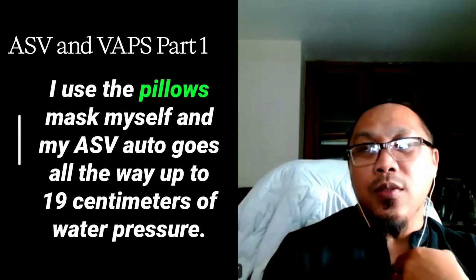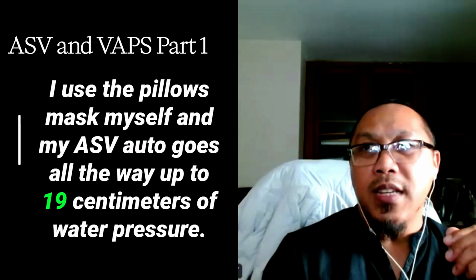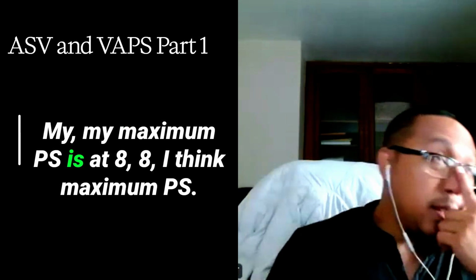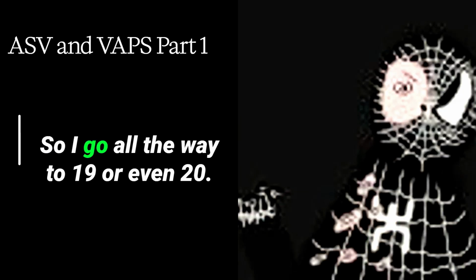I use a pillows mask myself and my ASV auto goes all the way up to 19 centimeters of water pressure. No problem. No leak. Yeah, 19. My maximum pressure support is at 8, I think. So I go all the way to 19 or even 20.